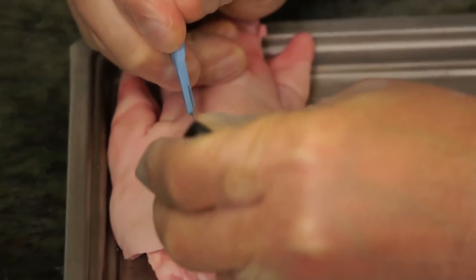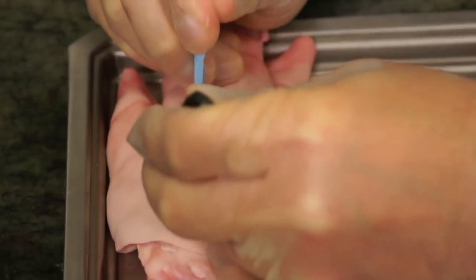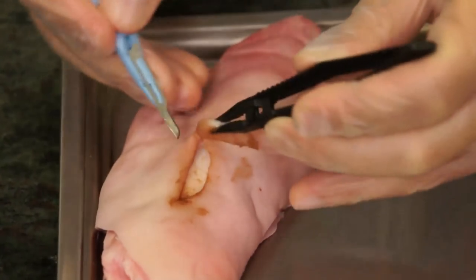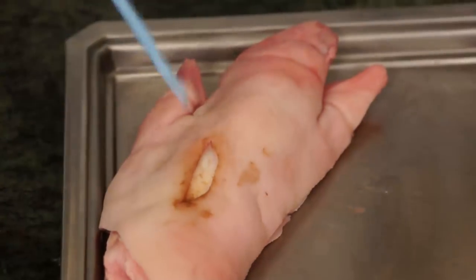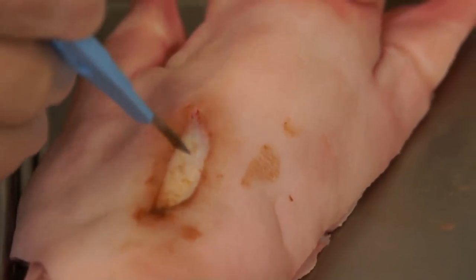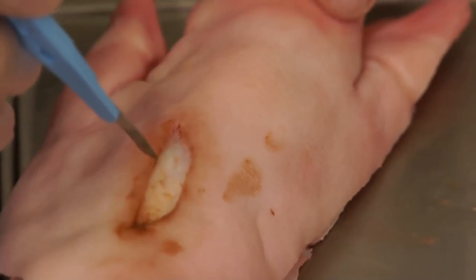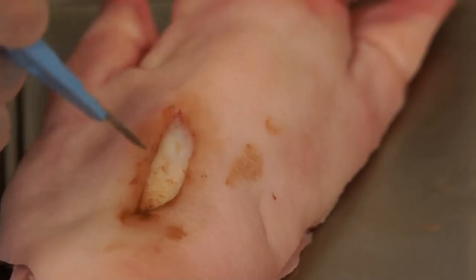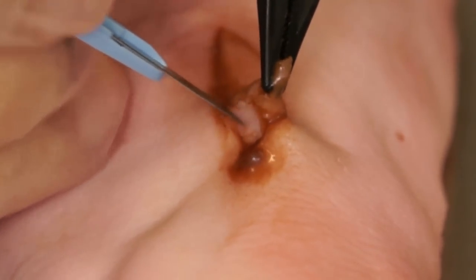It is common that the interface between the necrotic tissue and the healthy tissue is an area that can be sensitive to debridement without adequate anesthesia. In addition, this is where one will find the most vascular portion of the wound, and maintaining the interface just on the side of the necrotic tissue can minimize bleeding as well as discomfort.